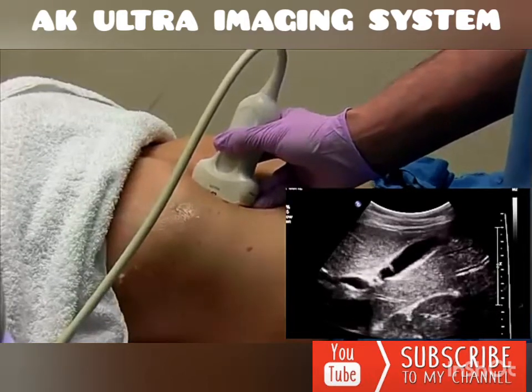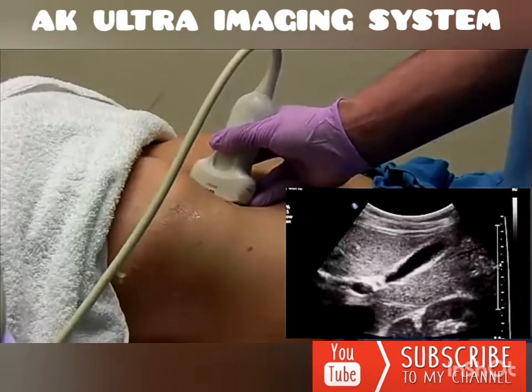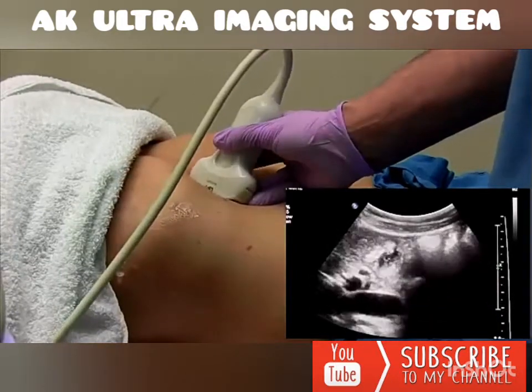So again, you might not be perfectly sagittal to the body to get a sagittal gallbladder. And from here, once you find that elongated gallbladder, you just sweep through.